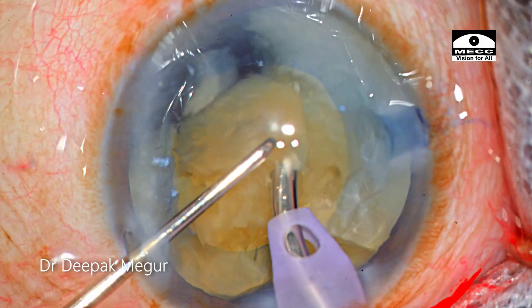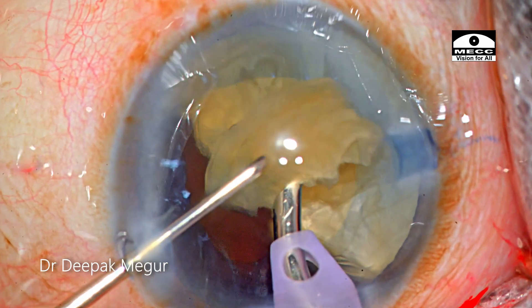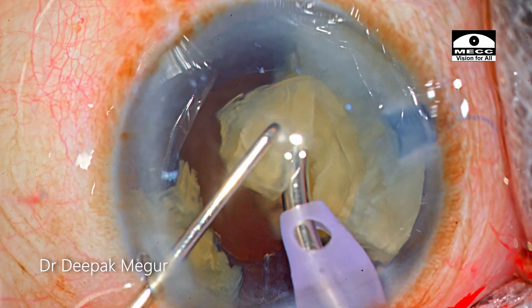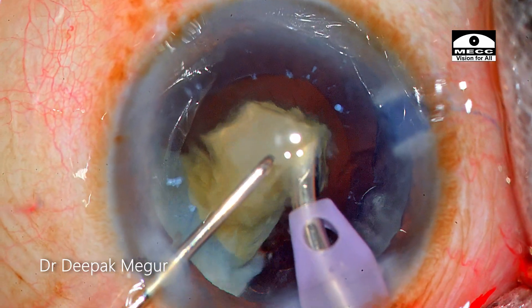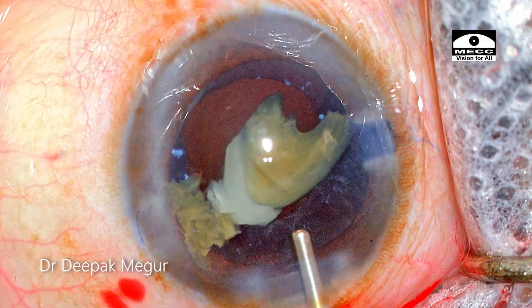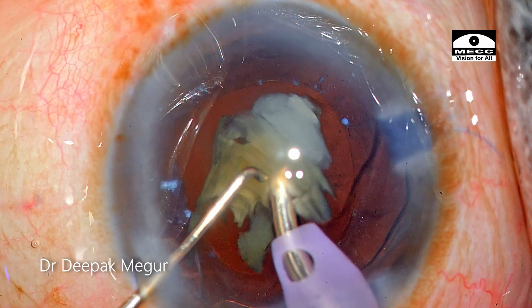Apart from the plane of emulsification, the amount of lens chatter and turbulence during surgery are important factors responsible for endothelial damage during phacoemulsification — it is not just the phaco power alone. Ideally, the fragment should not leave the tip once it is engaged; it should just dance around it until it vanishes. The secret to minimizing endothelial trauma is how we modulate energy delivery to minimize lens chatter and turbulence. Mechanical trauma by flying tiny fragments is more responsible for endothelial damage than the amount of ultrasonic energy used. With a proper strategy, we can have crystal-clear corneas on the first post-op day even in denser cataracts.